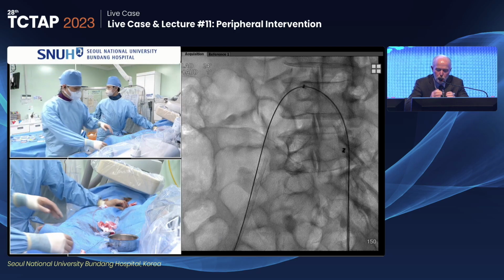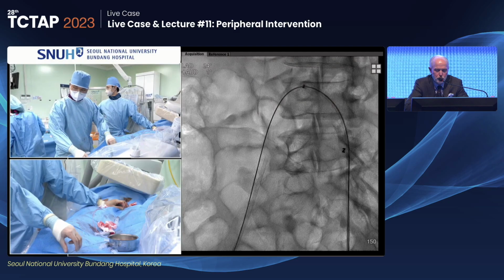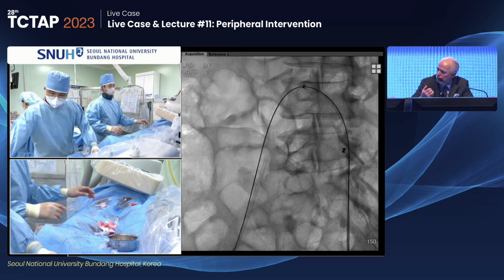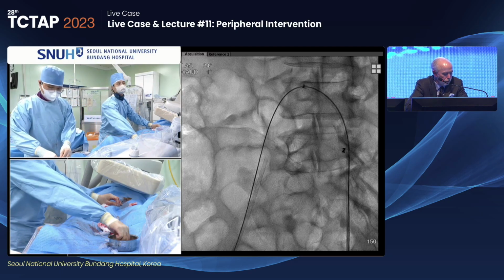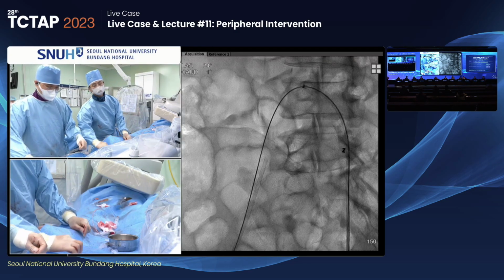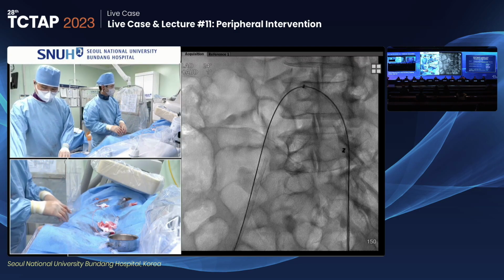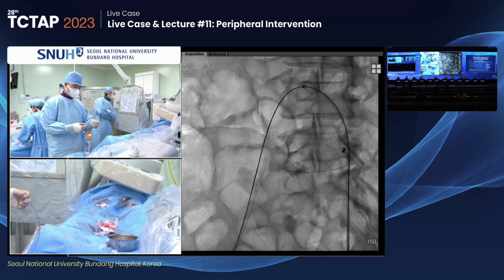And the stiff wire helps with that too. But you also want to have a big enough sheath that you can do injections and test while you're positioning the stent. In fact, if it is a live demo, I prefer the self-expanding stent. If it is daily practice, I have the courage to use balloon expandable.